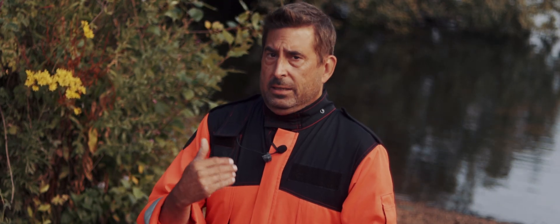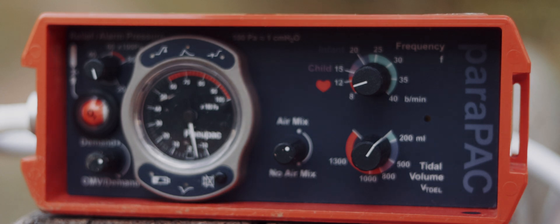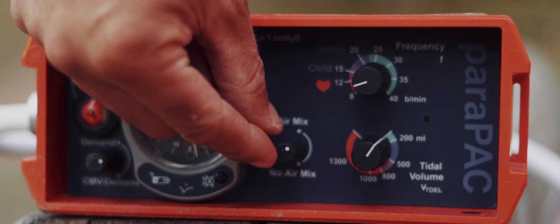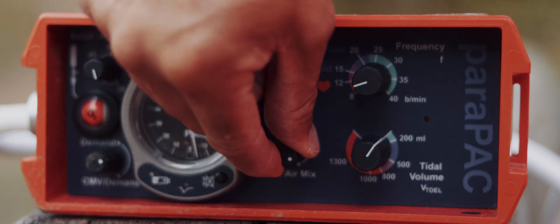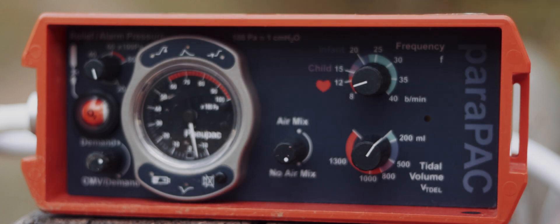Next, the Air Mix switch. When Air Mix is on, the ventilator gives 50% oxygen and 50% room air — useful for COPD and a few other specific cases. When Air Mix is off, it delivers 100% oxygen, which is exactly what you want during cardiac arrest.